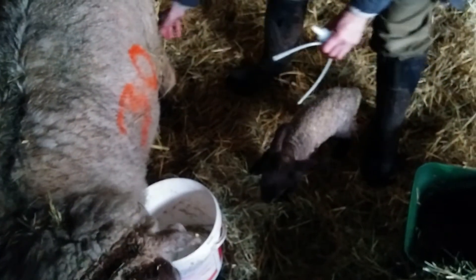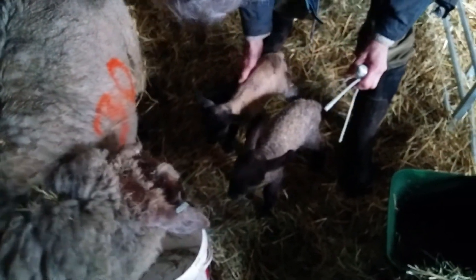She's a really nice quiet little sheep, which is possibly being a little bit too quiet.